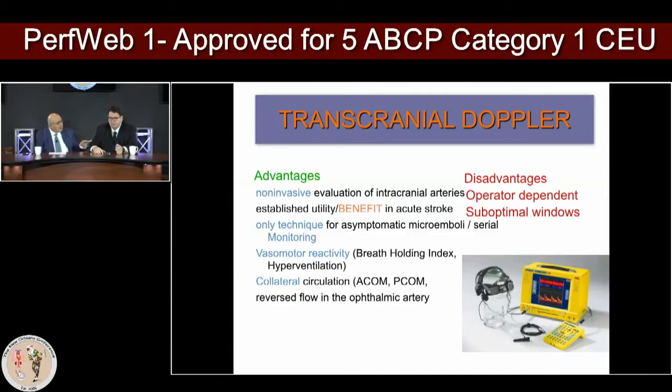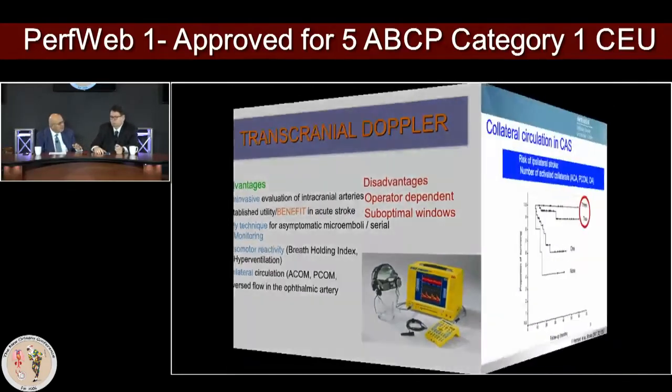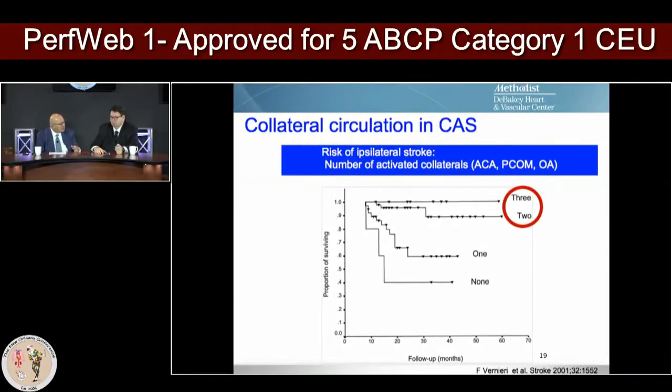On type 1 dissections with deep hypothermic circulatory arrest, you're talking about antegrade versus, of course you didn't mention it, retrograde. So if you don't have an intact circle of Willis and you've only cannulated unilaterally and you're flowing along, you won't know until after the procedure whether or not you actually perfused the contralateral hemisphere of the brain.